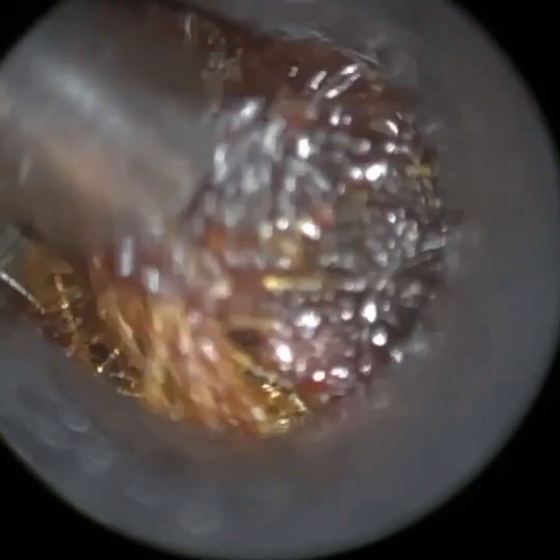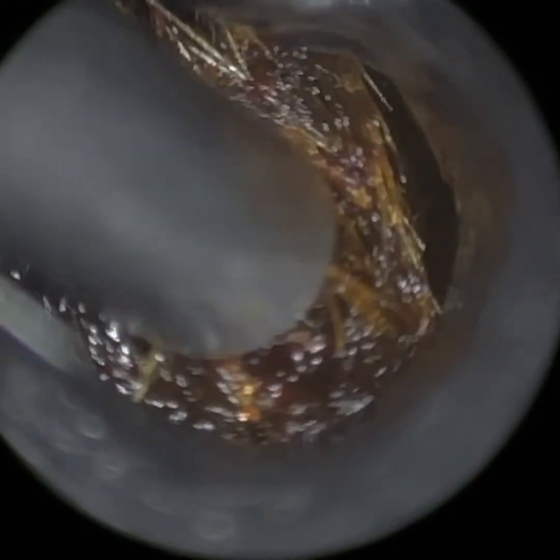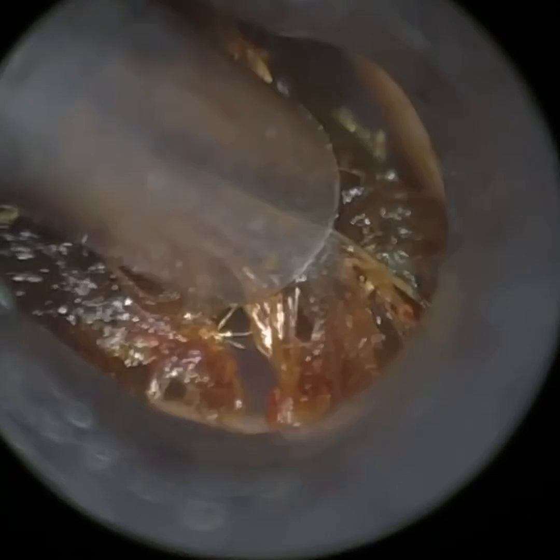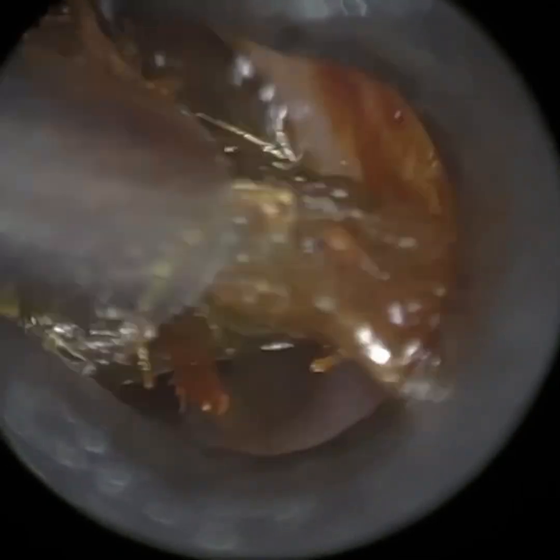You can see there are a few hairs in there. I'm just going to stretch this ear canal open. I'm going to obtain a suction grip and slowly but surely I'm now going to wriggle this out of the ear. As I'm wriggling it, I need to take into account the curvature of the patient's ear canal — so we're mitigating the bends, curling this around the bend. And you can see it's come out in a big piece.